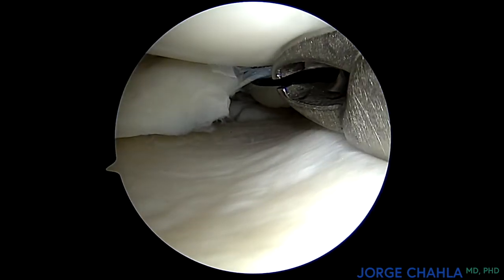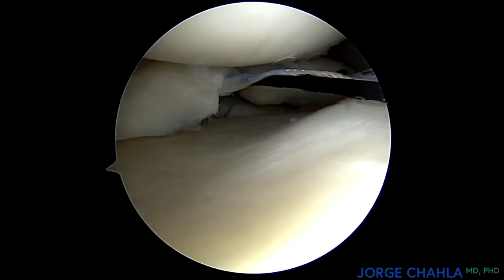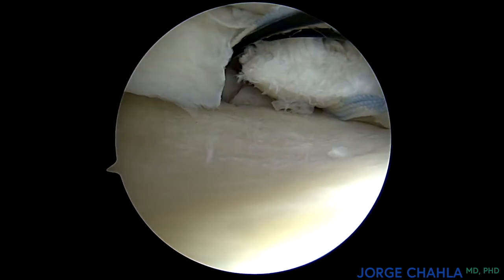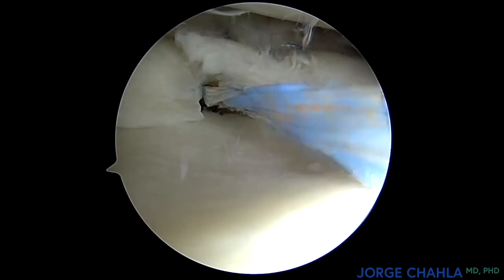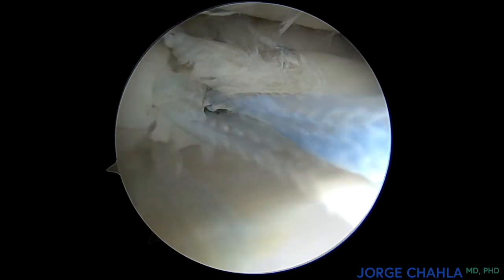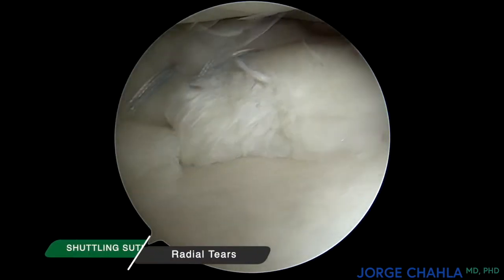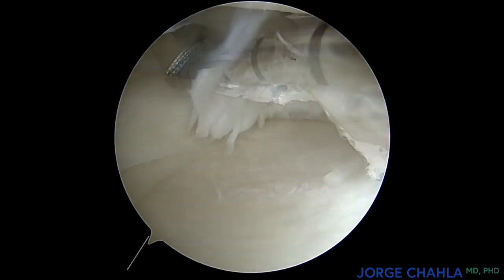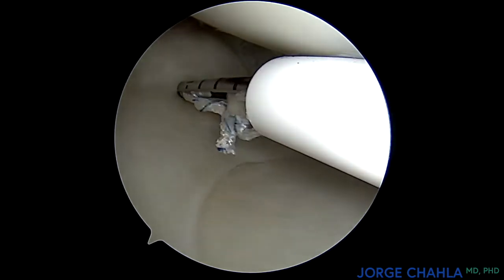A nitinol wire is utilized as a suture passing device through the transosseous tunnel. This is brought out through the cannula along with the radial tear meniscus sutures. These are then shuttled through the transosseous tunnel and, under direct visualization, tied over a button on the tibial cortex for appropriate tension and reduction of the radial tear.